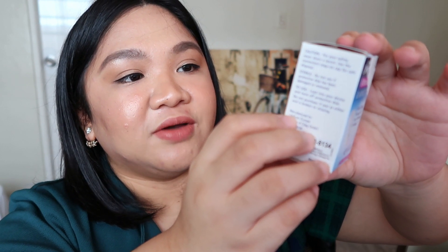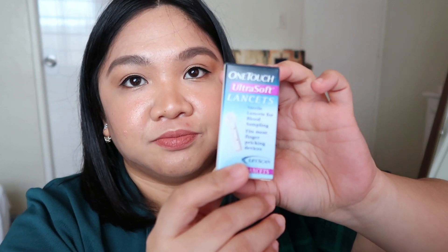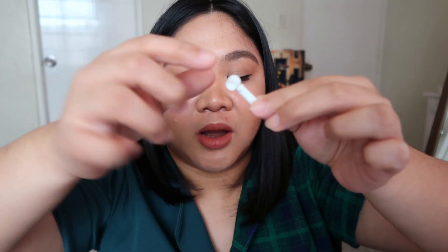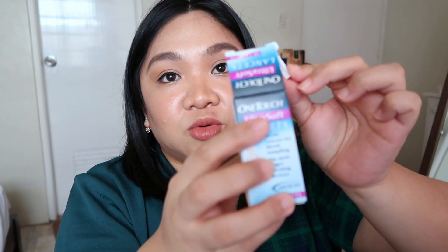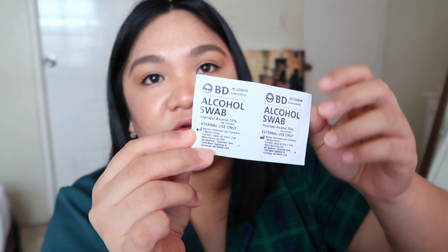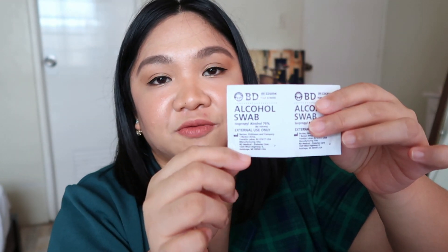And then this is the lancet — One Touch Ultra Soft lancet, 25 lancets. It's in its packaging in protection. When you use it, you just twist the cap. It's 25 pieces, about 100 to 180 pesos. I also bought some alcohol swabs — after you puncture, you use alcohol swabs to prevent infection.